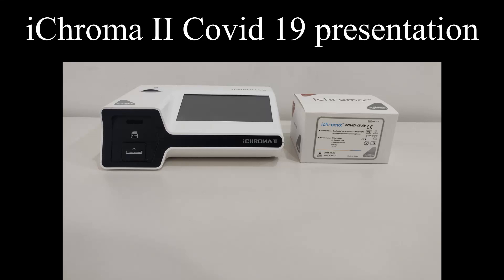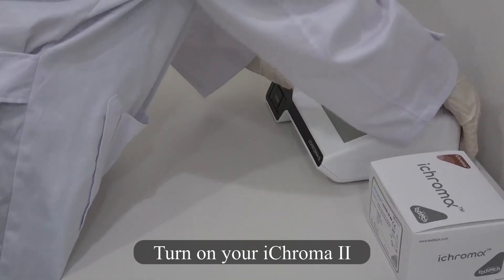iChroma 2 COVID-19 presentation. Turn on your iChroma 2.